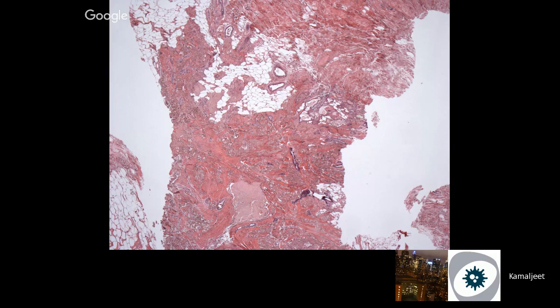And what would make you suspect that? If you see these tubular structures in the fat, without any myoepithelial cells, you will obviously do myoepithelial stains, and they will show a lack of myoepithelial cells. However, the caveat is, if the epithelial structure is within the fibroelastotic stroma, some of these can show loss of myoepithelial cells. They just inherently don't have it. So just be careful if you're doing a lot of myoepithelial stains. You cannot call it invasive unless you have an overtly infiltrative process outside the fibroelastosis.